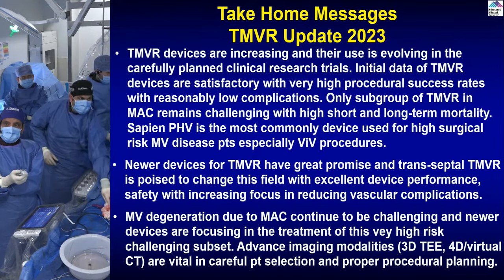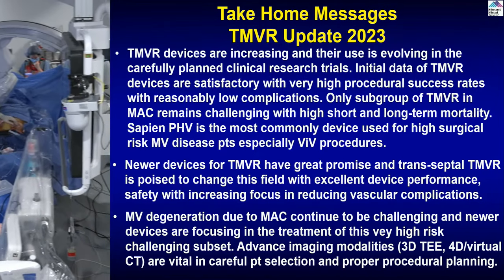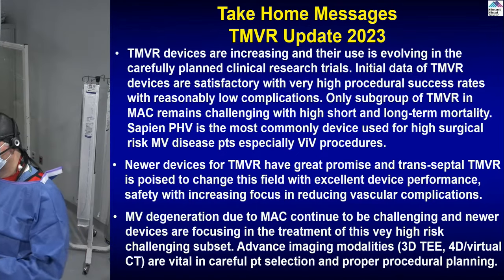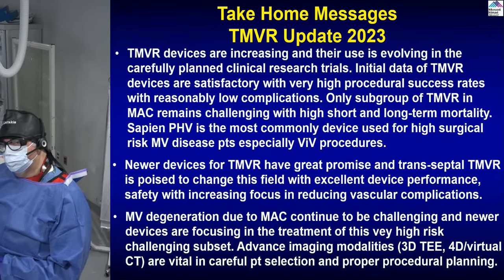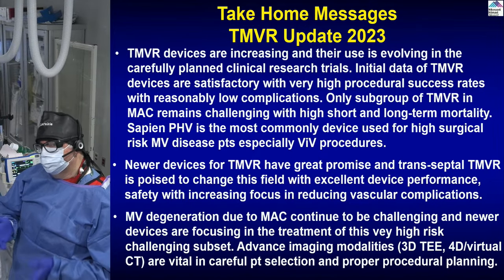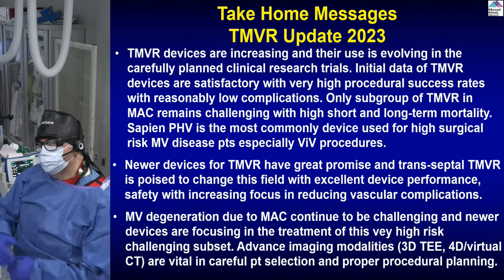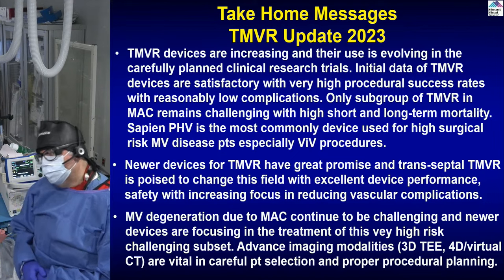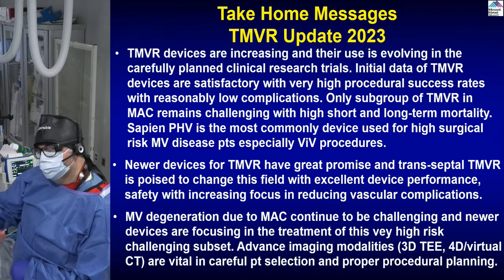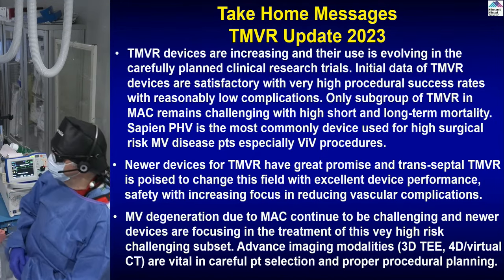Yeah, the same as Sahil said, you have to have circular calcium all around in order for the valve to anchor. The problem with this is also PVL, because if the valve deployment is not perfect, and because of the calcium everything is irregular, you may develop a PVL. So that's why valve-in-MAC is a very difficult procedure, and not like valve-in-ring or valve-in-valve procedures.